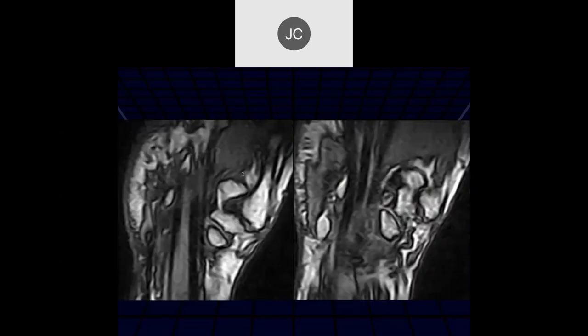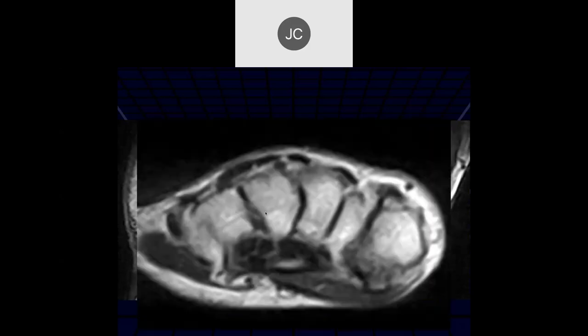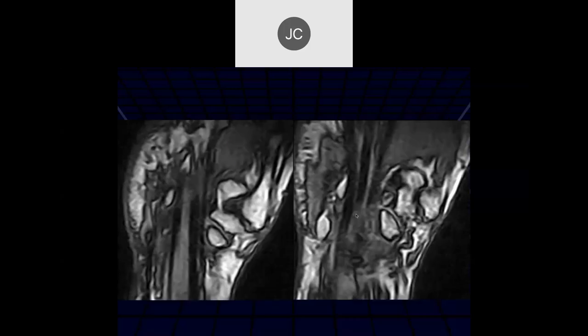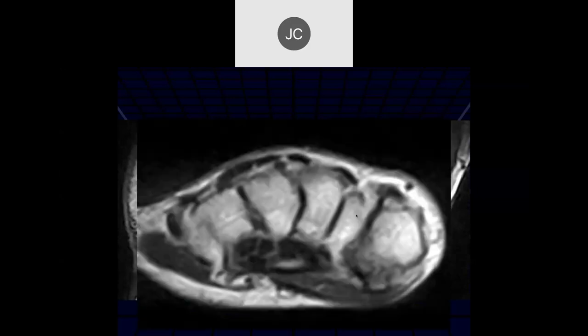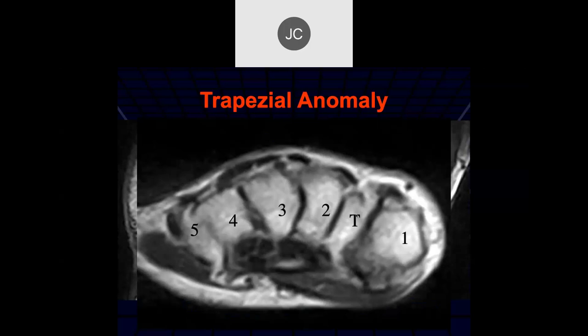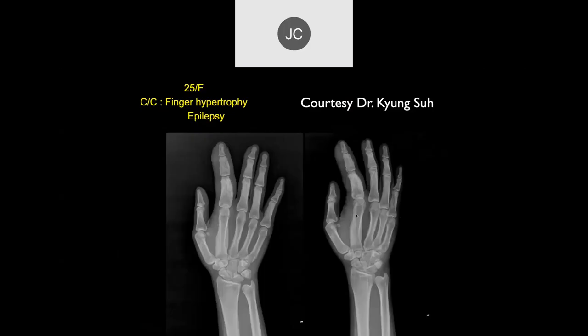Here we see a big deformity between the regular carpal bones — a trapezial anomaly. It probably has a name that I haven't been able to find, but it's an uncommon though not rare deformity of the carpal bones — an abnormal trapezium.